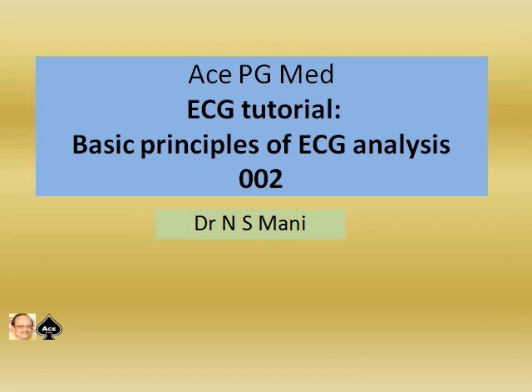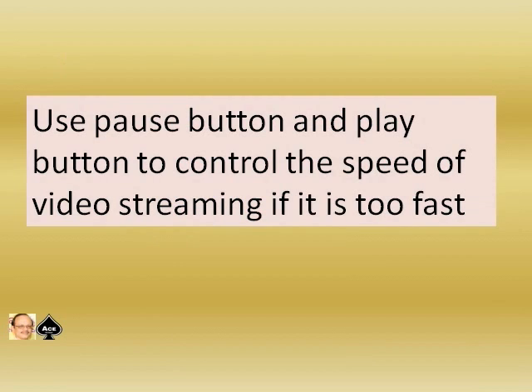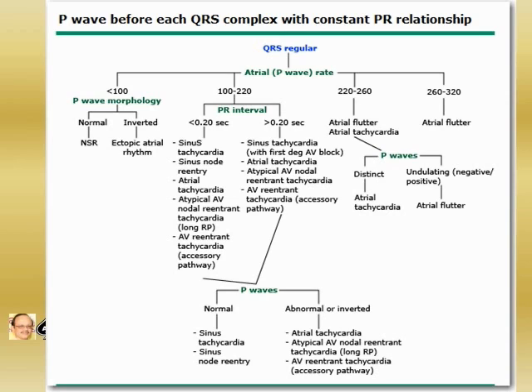This is the second part of the basic principles of ECG analysis. This is actually a series of more than 10 videos. Each video will be around 15 minutes. You can use the pause button and play button to control the speed of the video streaming if it is too fast.